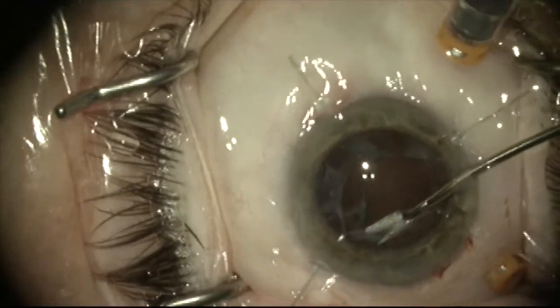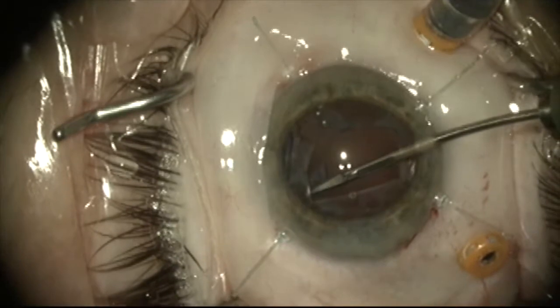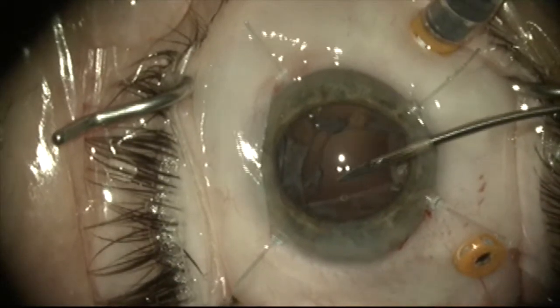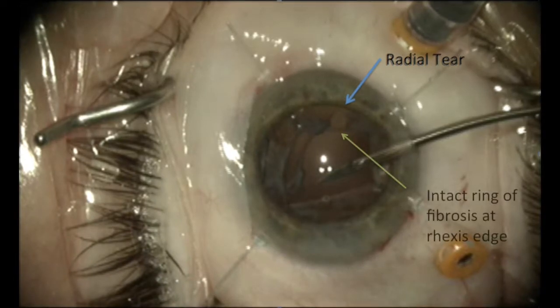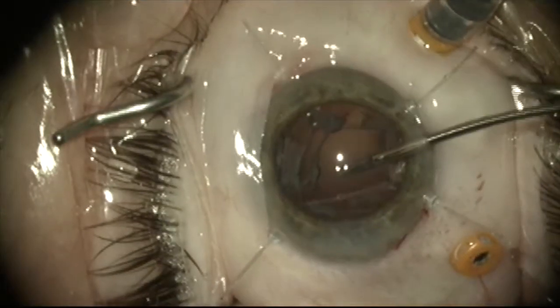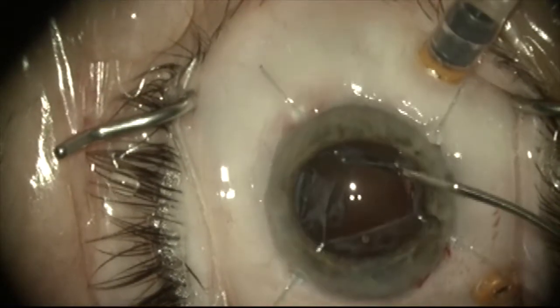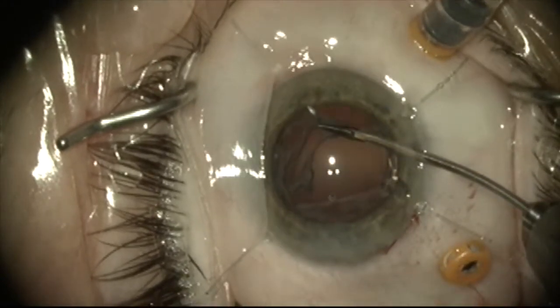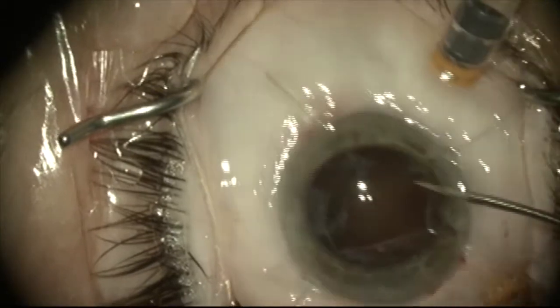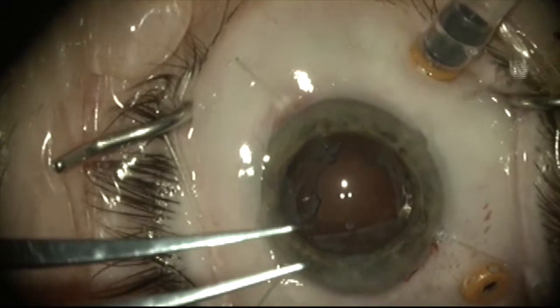I'm going to try to create a pocket to optic capture the lens. I'm dissecting away some of the fibrosis between the anterior and posterior capsule, and you can see that a radial tear has developed at about 12:30 to 1 o'clock, despite the fact that the fibrosis at the edge of the capsule rim is intact. So it appears that the underlying capsule was deficient and tore out.